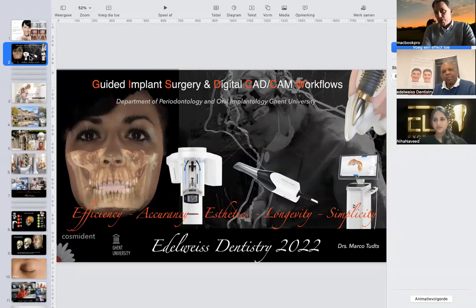At the moment you take a CBCT scan, there is a tool inside which also makes a scan of the face and which is mimicking the face of the patient over all the CBCT data.